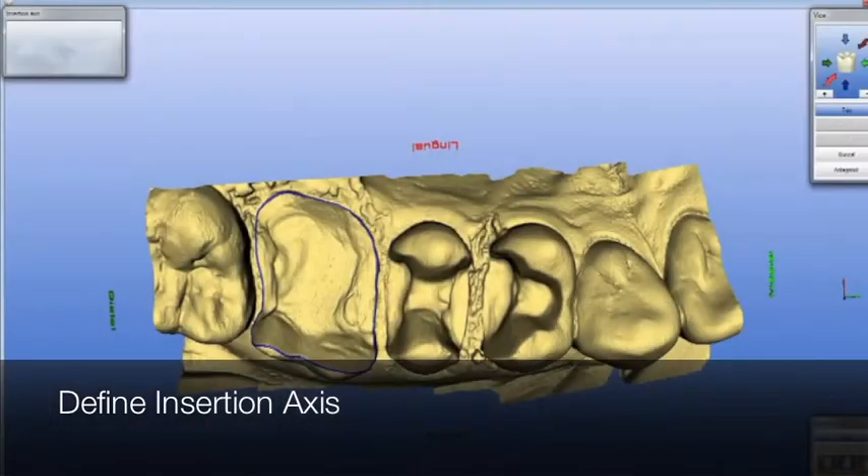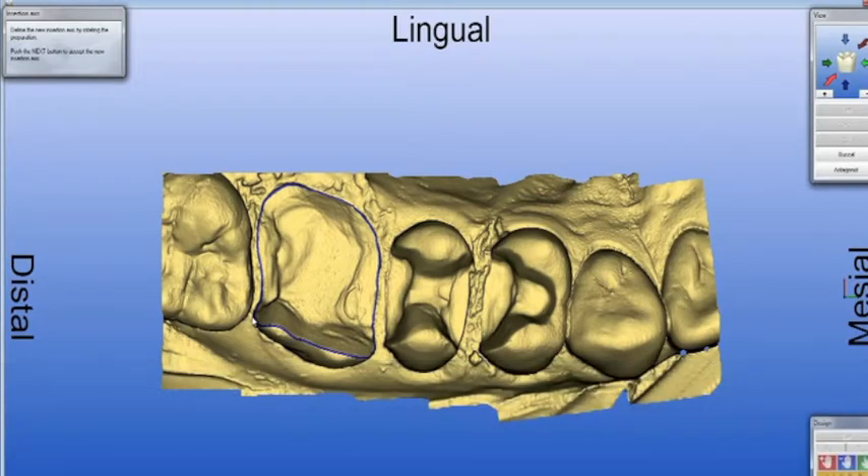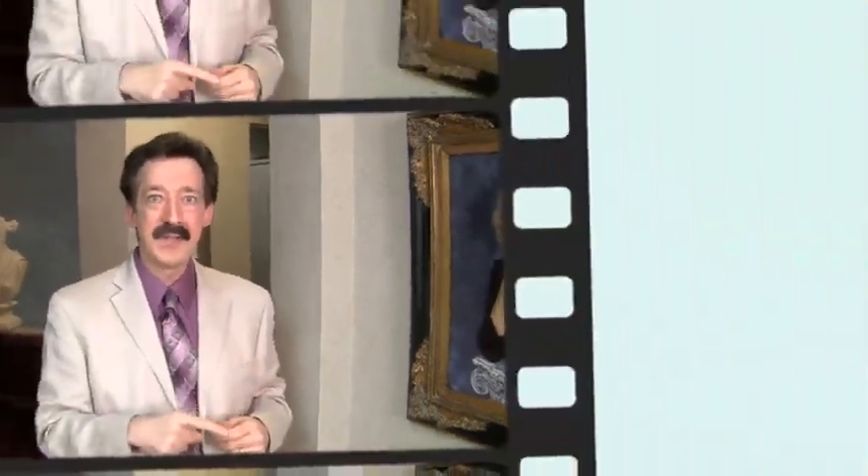Once you've outlined your margins, you hit the green arrow. Your next screen is insertion axis. Here's the secret: if you've prepared your case right and taken the proper angle of optical impression, I don't usually change the insertion axis, because the information was already entered into the computer at the proper angles. So I hit the green arrow again.